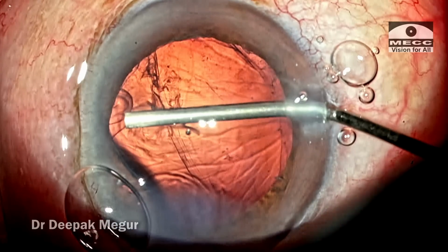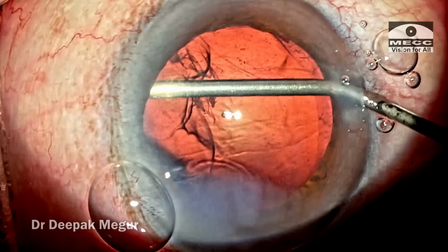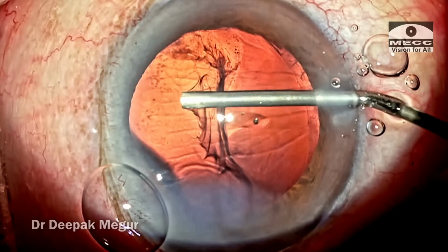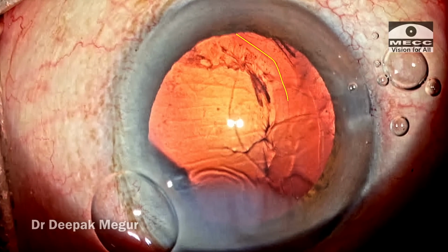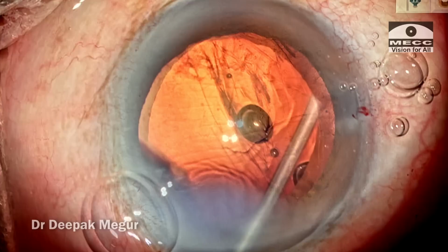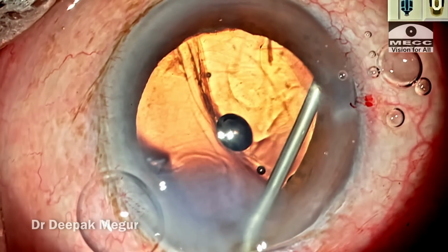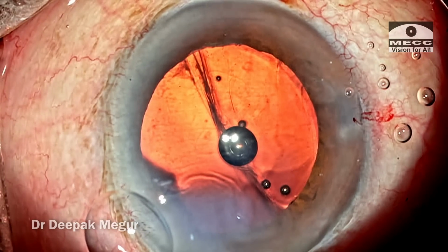Since there is no vitreous disturbance, I thought let me place the lens first. I'm going to use this OVD to create some space under the iris and above the capsule. So as soon as I'm doing this, I can see a linear fold. It looks like a crumpled posterior capsule at one end. The left hand side has an intact posterior capsule. The right hand, the entire posterior capsule is crumpled to the center. That's what it looks like.